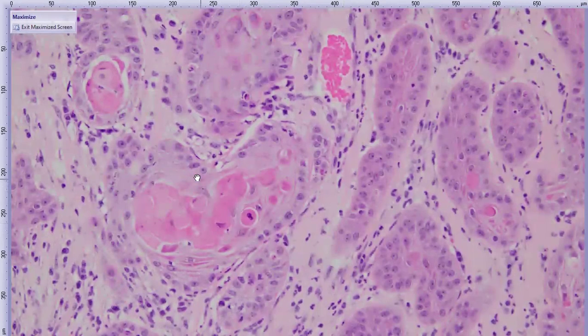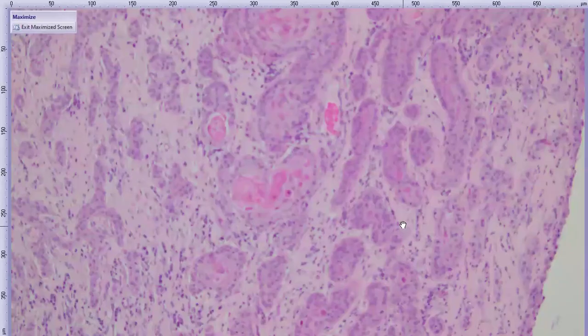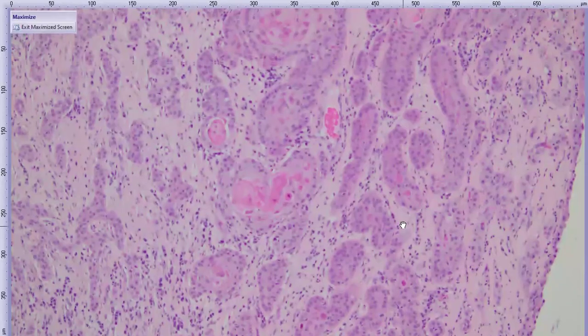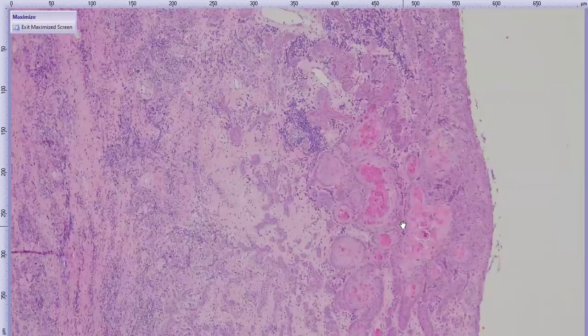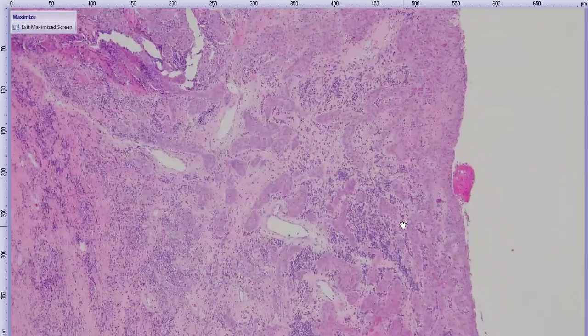And many of these lobules of neoplastic cells are keratinizing towards their middle, essentially forming keratin pearls or discohesive keratinized cells in the centers. Brightly eosinophilic, lots of cytoplasm. So long story short, we have a squamous cell carcinoma, which was their differential. So histology supports their clinical interpretation, which is always nice.